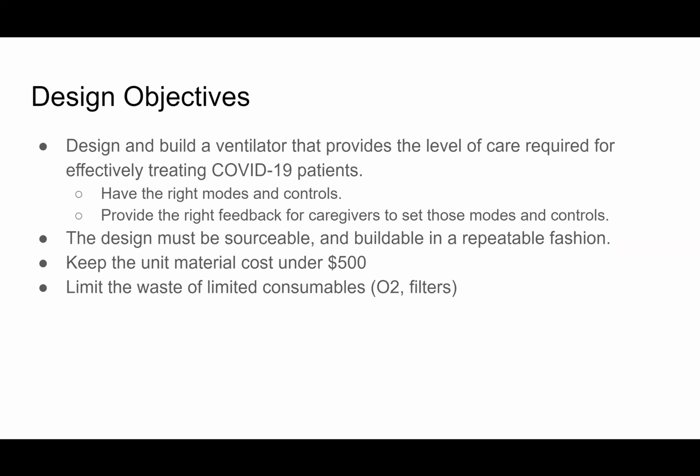Our overall design objective is to design and build a ventilator that provides the level of care required for effectively treating COVID-19 patients. There are a lot of projects out there that aim to inflate a bag or make a test lung move, and we're trying to be a bit more focused. With all our doctors and our reviews of the papers, we're trying to make sure that we really have the right modes and controls specifically for the type of treatment that ARDS COVID-19 patients will need to make it all the way from disease to recovery.